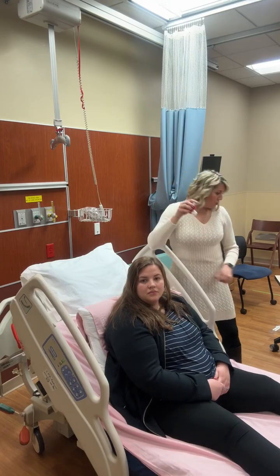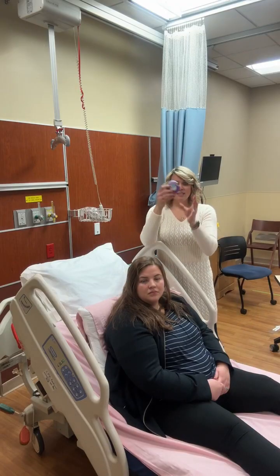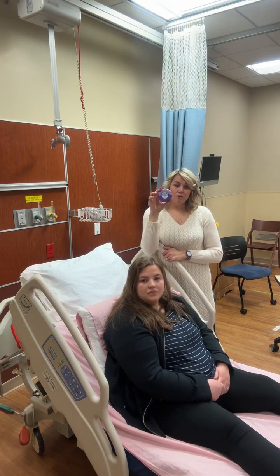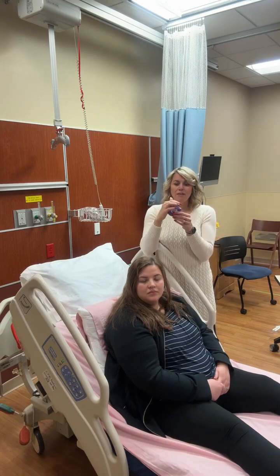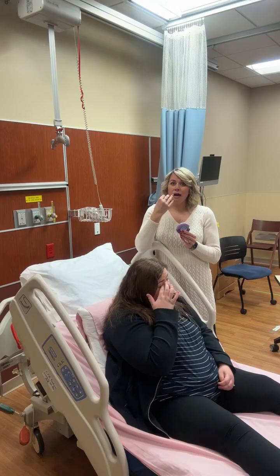We're also going to review medications that look like this. This is an Advair, and it's typically purple, and this medication is a corticosteroid, and it's also a dry powder inhaler, okay? So dry powder means that the patient is actually inhaling a dry powder that is in some sort of a capsule.